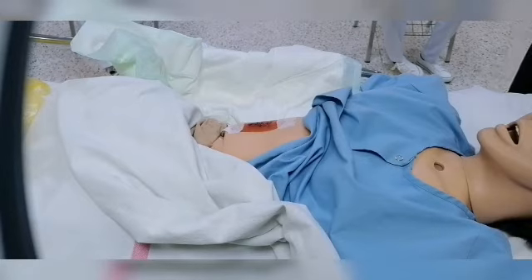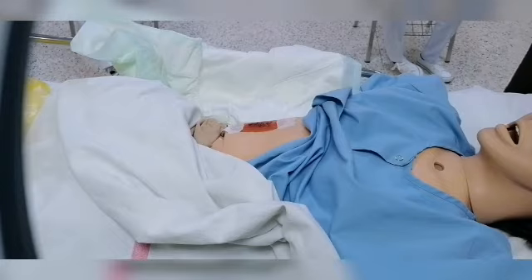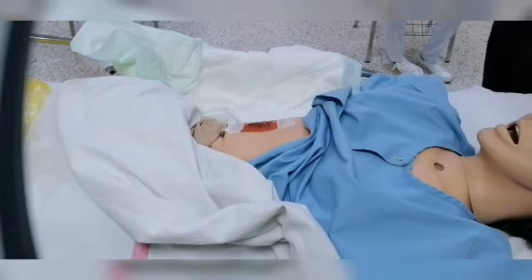I have to put it while being away from the dressing set and not touching the sterile field. Then I have to wear the sterile gloves.